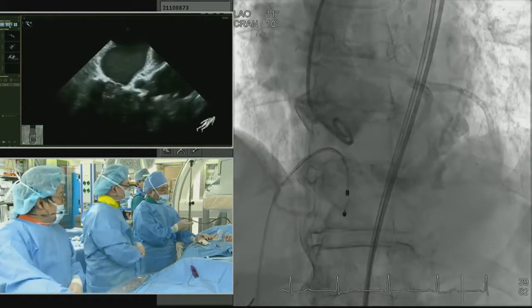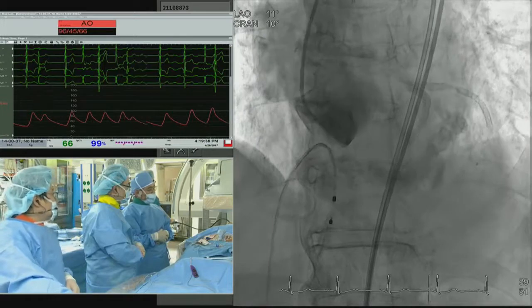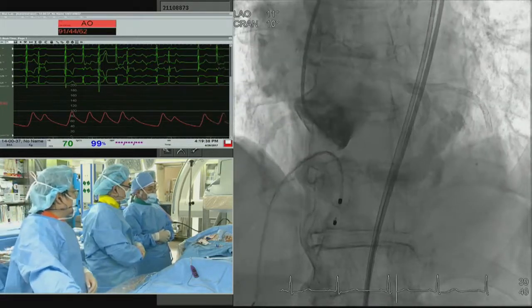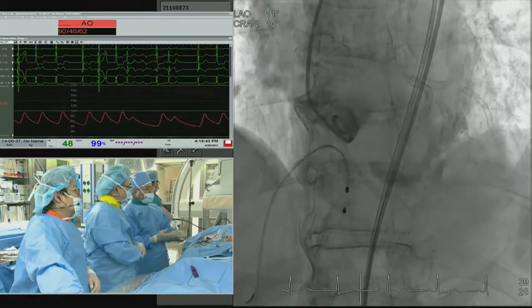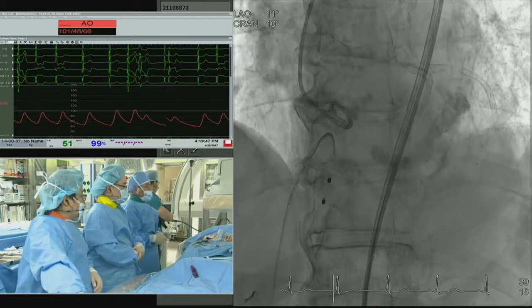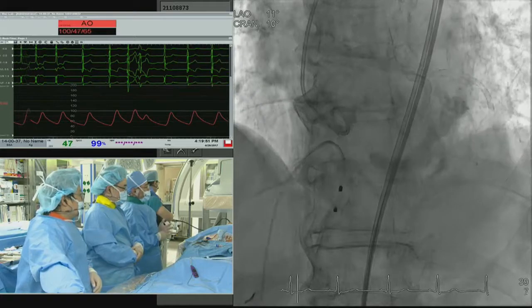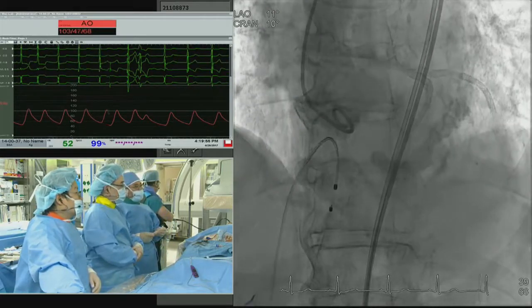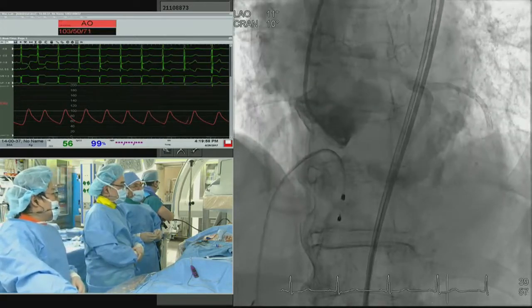Very nice. Yes, if the echocardiographer wants to comment on that, simply because there is a little bit of a sigmoid septum appearance with a little bit of a bulge of the upper septum. That is one thing that comes to mind. But otherwise, you have a beautiful view that's perpendicular to the sinuses to work on. Yeah, go ahead and proceed.